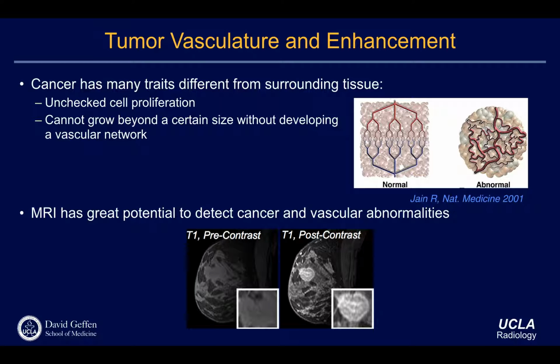I remember that signal... well, first of all, what method is it? It's an RF spoiled gradient echo sequence, right? I'm not sure if I remember the signal, but shortening the T1 increases the... I mean, the tissue with the short T1 is higher.